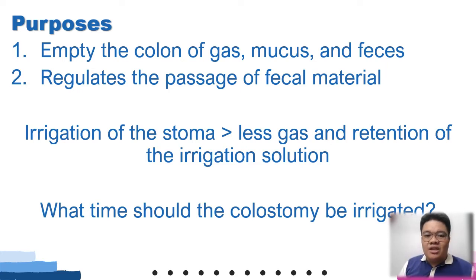Now, irrigation of the stoma. When I say irrigation, you would want the gas to be out. You would want the stool to be out. You're getting them out. So the irrigation of the stoma results in less gas and retention of the irrigation solution.